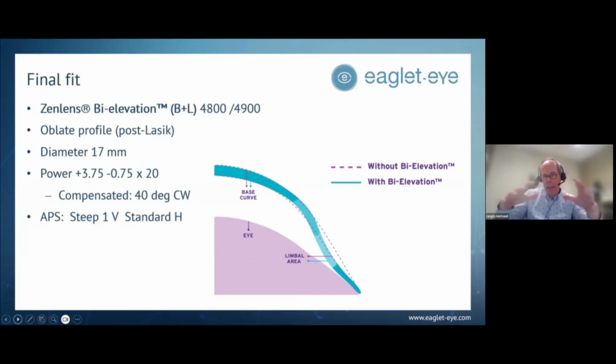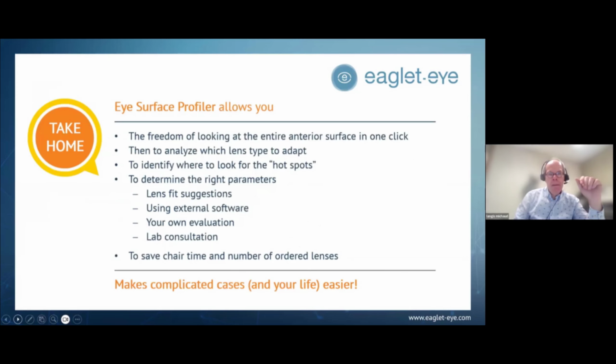to determine and to share the toricity from the conjunctiva and the inner portion of the lens. So in that case, we decided to go with a larger lens, 17 millimeter, because of the size of the cornea, and because of the dryness of the eye. When you treat eye dryness, you need a larger lens in order to vault and to cover most of the area that is exposed to atmosphere, air, and with the eyes open. So the 17 millimeter was selected.